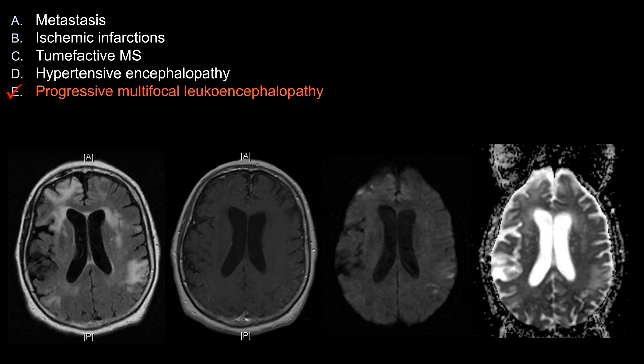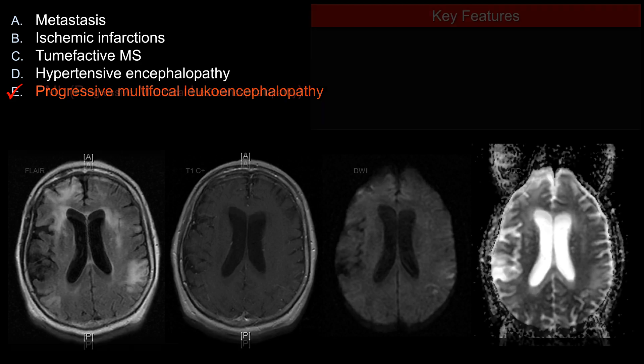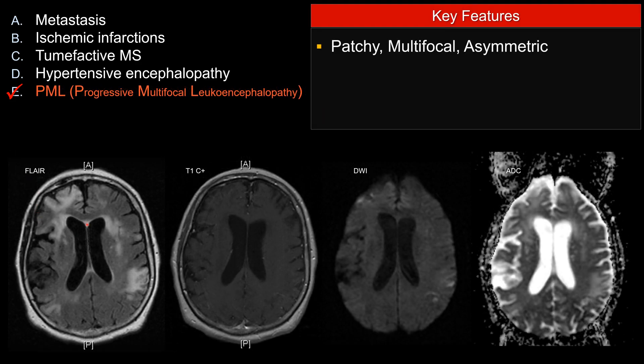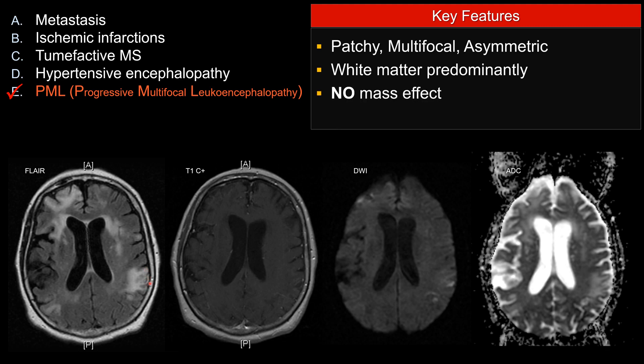The best choice is E, PML. Let's look at some of the features that make PML the best answer here. You can see on FLAIR there are multiple patchy T2 FLAIR bright lesions that center within the white matter with involvement of subcortical U-fibers as well as some cortical involvement. The lesion has very little mass effect, so that distinguishes it from other neoplasms.